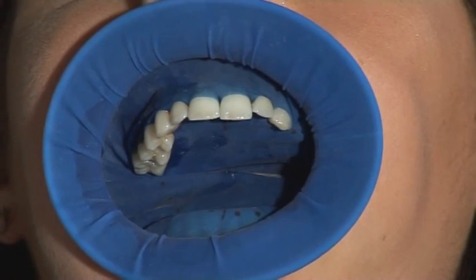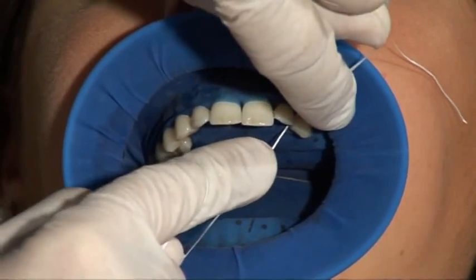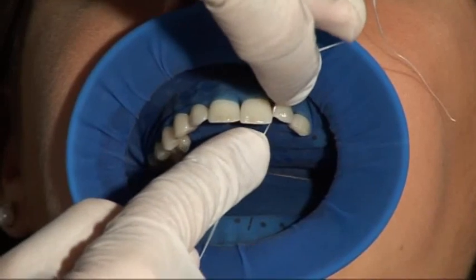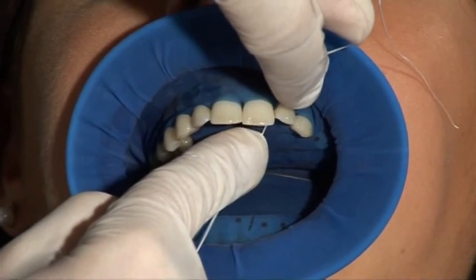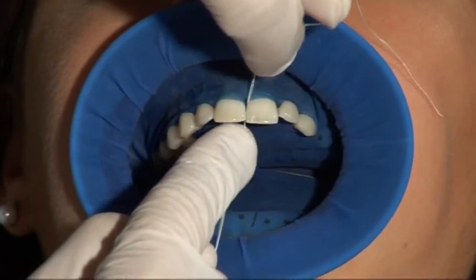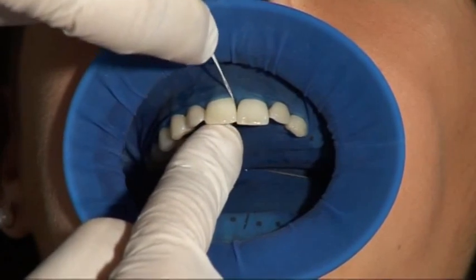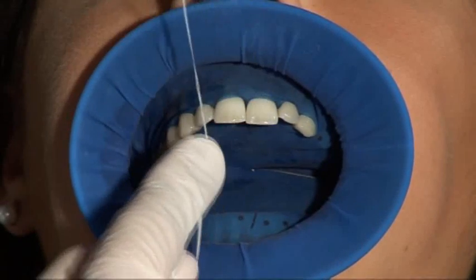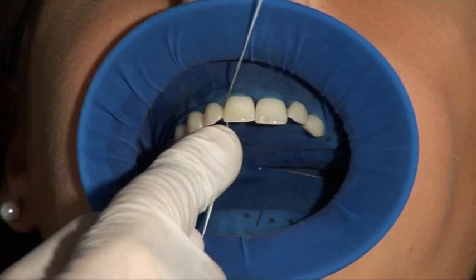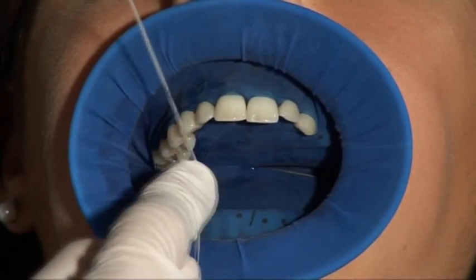Once all septa have been slipped through the contact points, you can use dental floss to advance the Optredam even deeper into the interdental spaces if necessary. In case of more deeply located cavities and to achieve perfect dryness, the Optredam can be placed deep in the sulcus using the spatula. Because of the automatic pull in the fold, the Optredam stays automatically in the sulcus and ensures very good dryness.